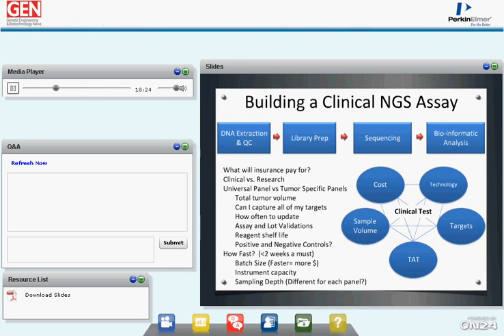And then really, from a turnaround time perspective, in the clinical setting, these results need to be out in less than 2 weeks. So that means we need to have the appropriate batch sizes. We can batch every single day and get results out pretty quickly, but that's going to cost more money. Essentially, it's like looking at a dishwasher. You can run the dishwasher when it's not full, or you can wait until it's full. And so operationally, those are challenges that we need to figure out.